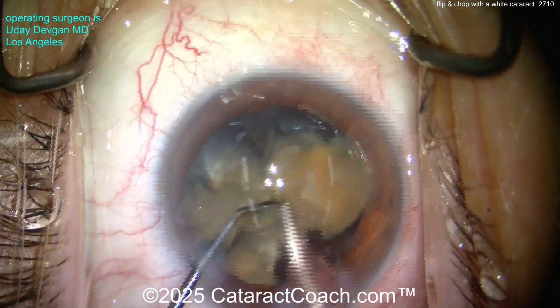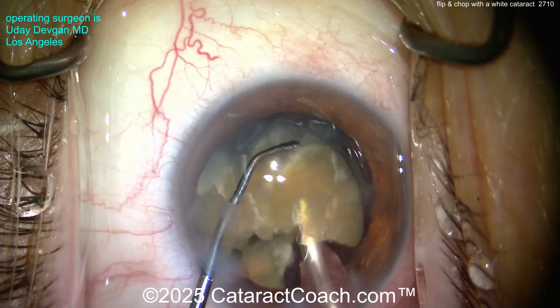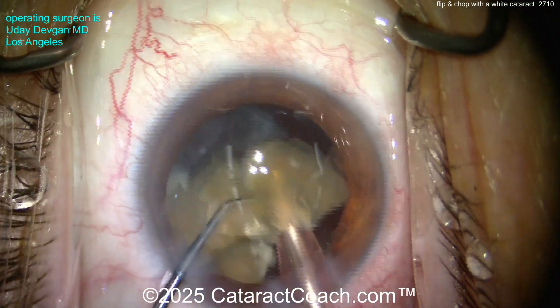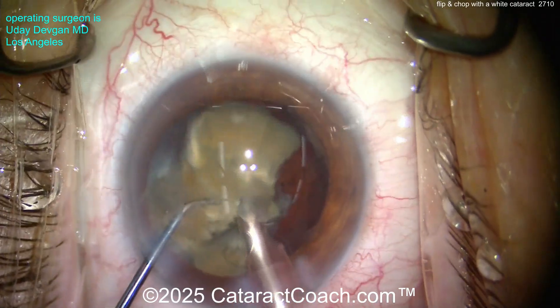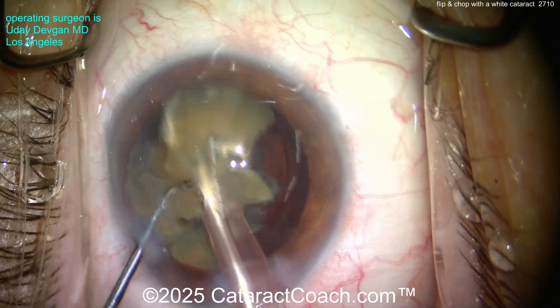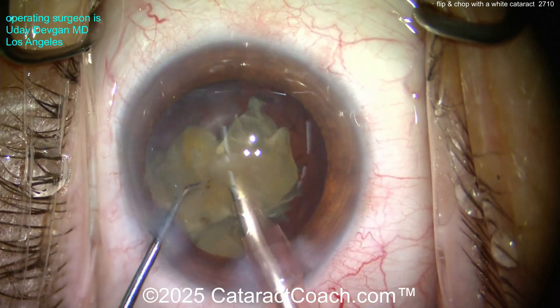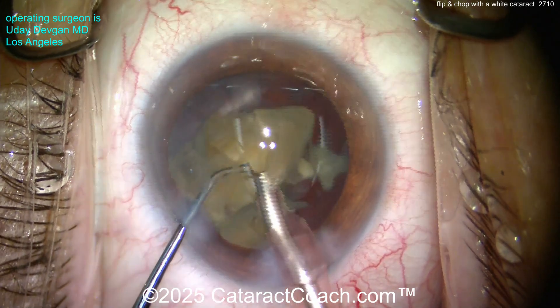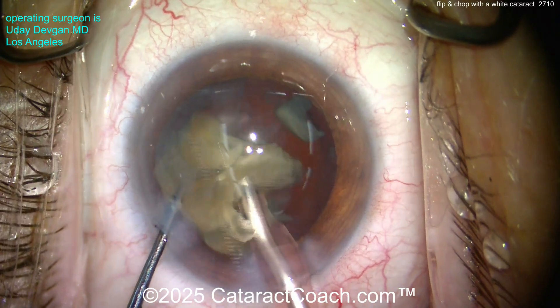These are going to be relatively easy to emulsify. Video is shown here in real time, so it's a little bit of a longer case. We didn't catch the beginning of the video because my technician in the operating room didn't hit record until the rhexis was done, but you saw the important points. Buzz into the nucleus — there it is. If you need to, you can sub-chop, but these aren't so dense you can't emulsify them, so we'll emulsify here, taking our time.